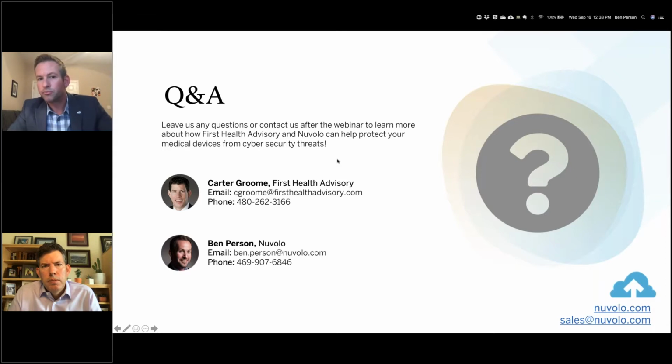We also can utilize that data as it relates to doing PM scheduling. Maybe in addition to your scheduled Joint Commission or AEM schedule, you also want to look at utilization measures, or when the device is being used the least, to schedule that time to have an HTM tech or engineer go out and do the work. Dustin, hopefully that answered your question. If not, feel free to ask a follow-up.